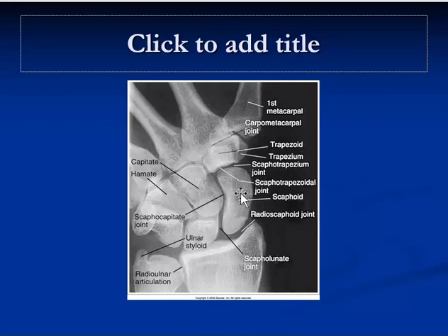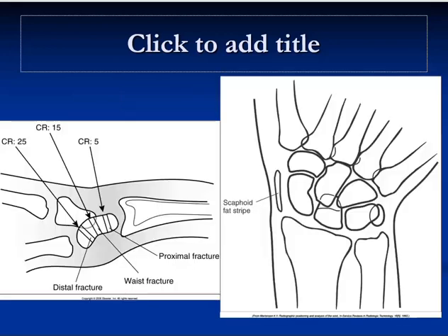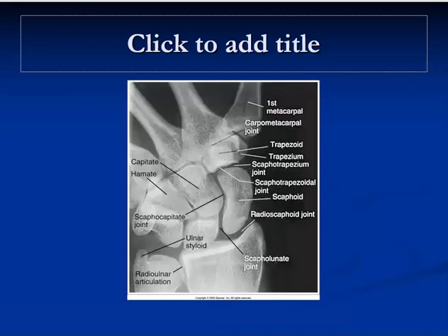So you can collimate down to a very small area, just to improve the appearance of the bone that you're interested in seeing. So again, 15-degree cephalic angulation, or elevate the hand so that it's at an angulation of about 15 degrees. Ulnar flex it, that desuperimposes, plus it puts the central ray more perpendicular to most of the scaphoid itself, and collimate down, and you can get a very nice image.